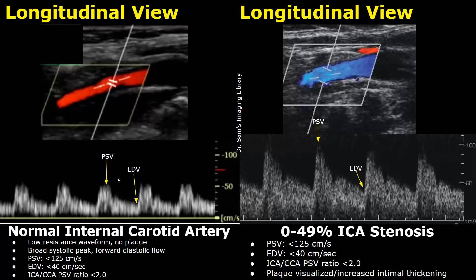In this image, the PSV is slightly more than 50 cm per second and the EDV is around 25 cm per second. This is an image of internal carotid artery stenosis — a 0 to 49% stenosis. In this case, the PSV and EDV values will be normal, and the ICA to CCA PSV ratio will also be normal. But a plaque will be seen within the lumen or there will be increased intimal thickening. Here, the PSV is around 100 cm per second and the EDV is around 40 cm per second.